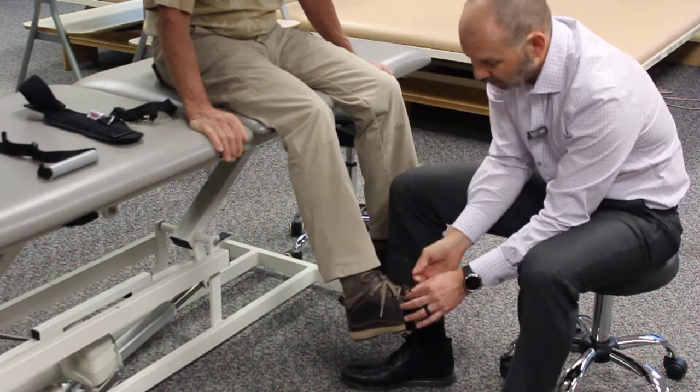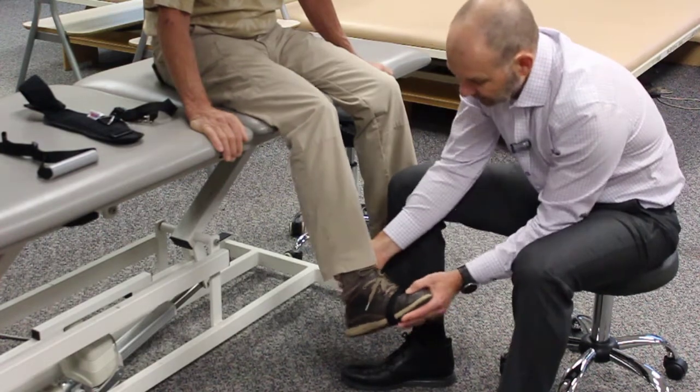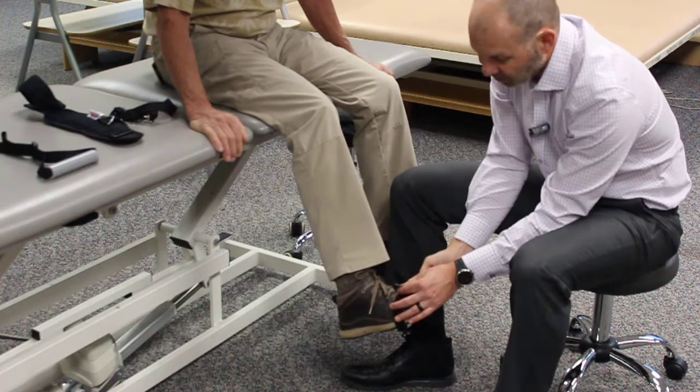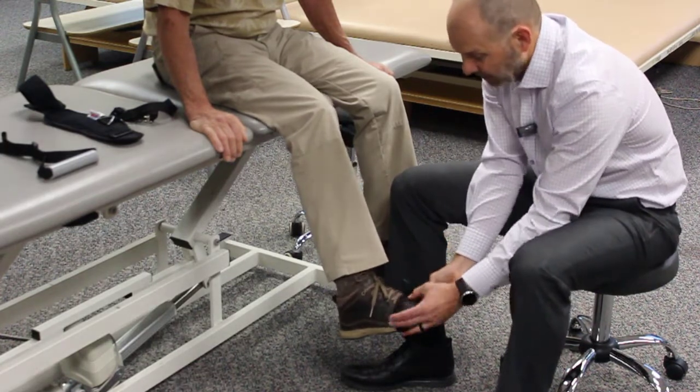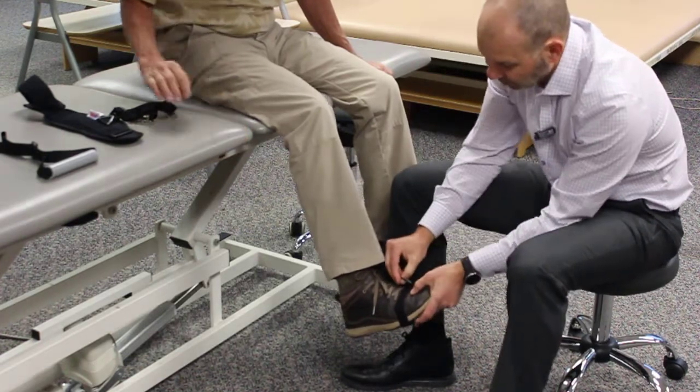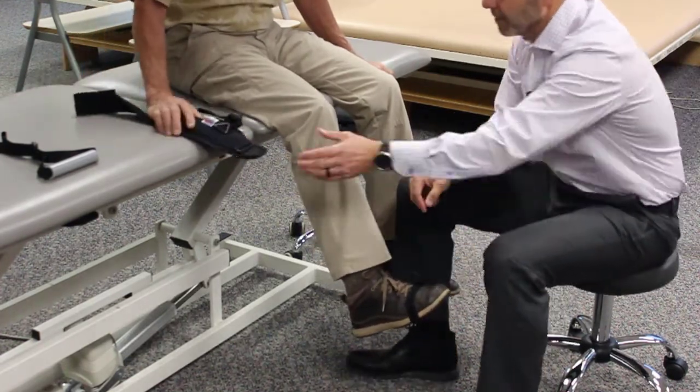But if I want to pull more into eversion, we're going to place that triangle more on the medial side. So I'm going to anchor this triangle a little bit more to that medial side there, so we're going to get a little more of a pull in that everted position here.